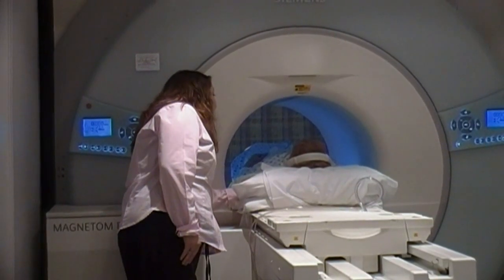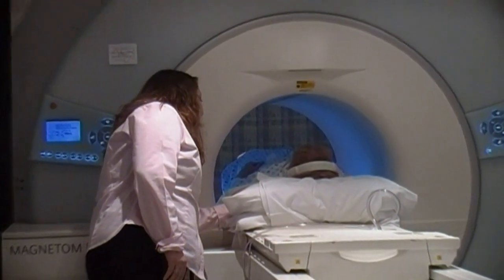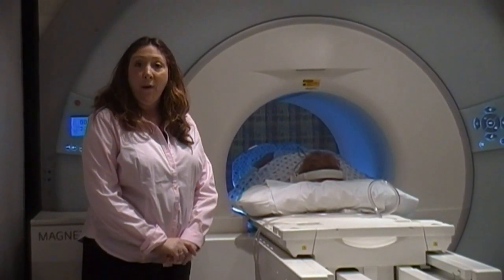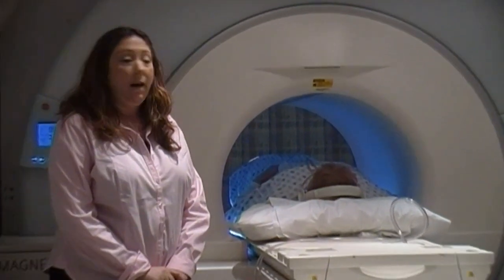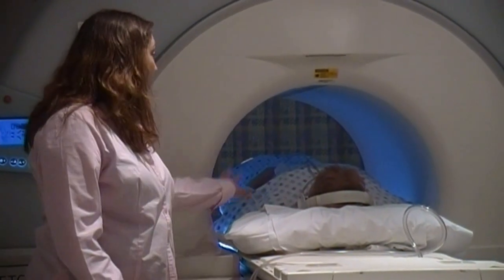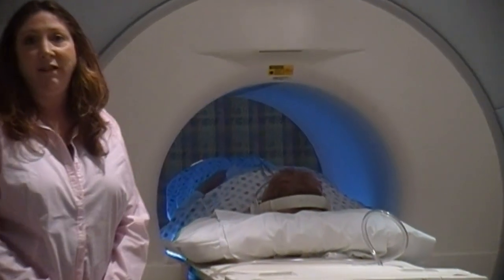Now this is where you'll be. I will check the intercom to make sure that we can hear each other okay, and then we'll get started. The exam is going to take approximately 30 minutes. Some exams are shorter, some are a little bit longer, but as you can see, there's plenty of room in here for the patient.